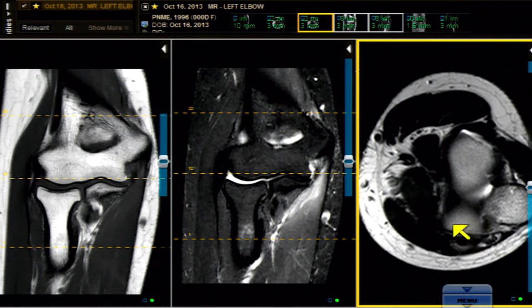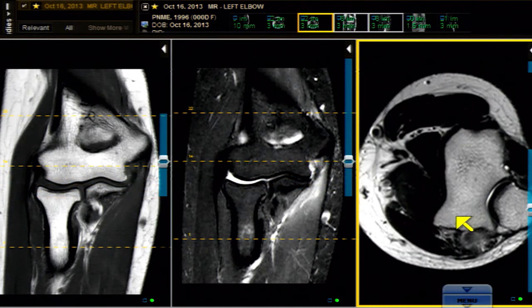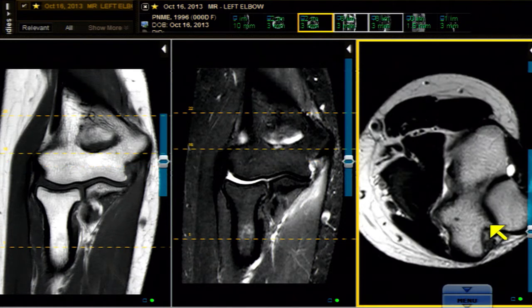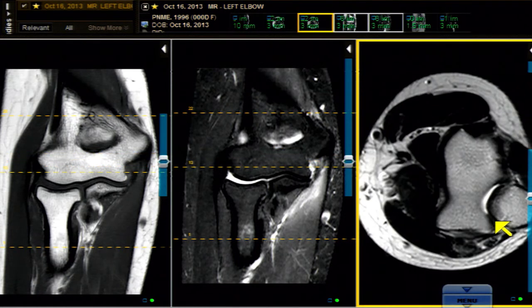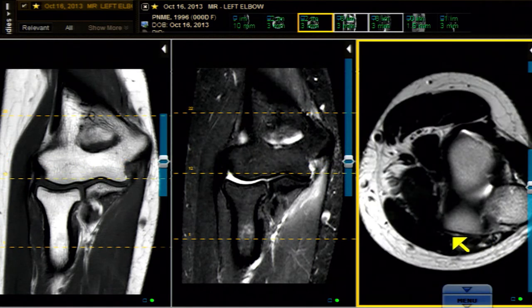Don't confuse this with the fact that there are other bundles of the MCL — there is an arcuate bundle of Osborne and a transverse bundle — but those are not important here. We're only concerned with the anteroposterior fibers and the proximal-distal fibers of the anterior band of the UCL, which are right here.